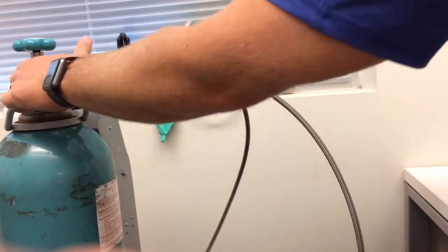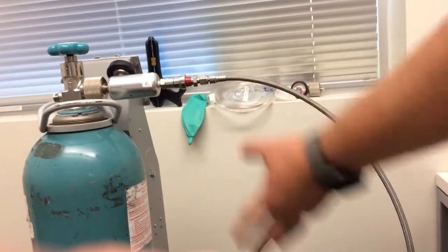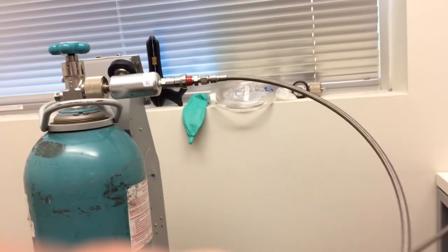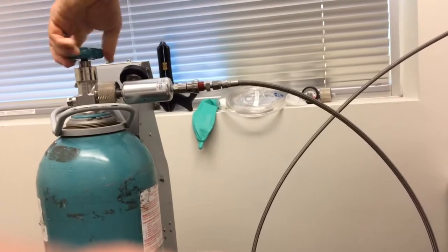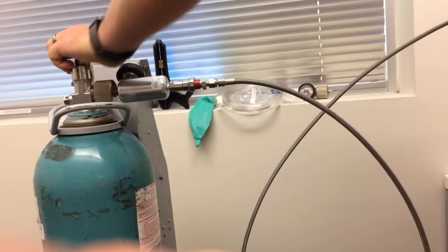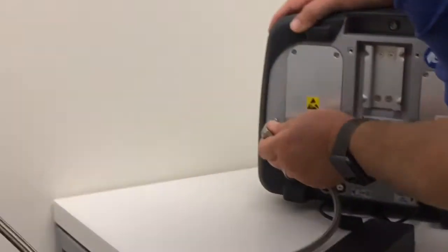This quick connects into the regulator like this. But this regulator hooks to a small cylinder as well as a big cylinder. The proper procedure is to turn the gas on, turn it off, and then we'll hit our purge just like that.